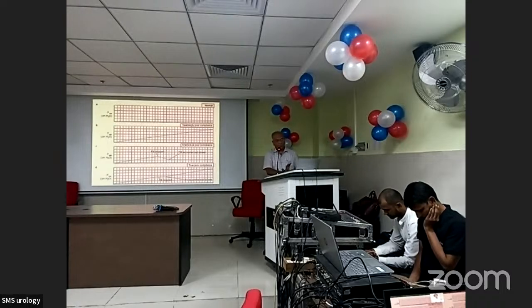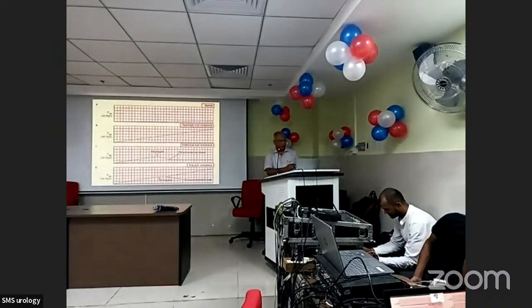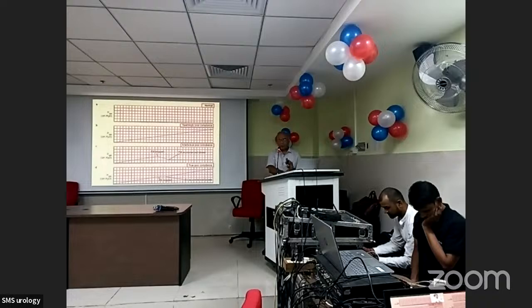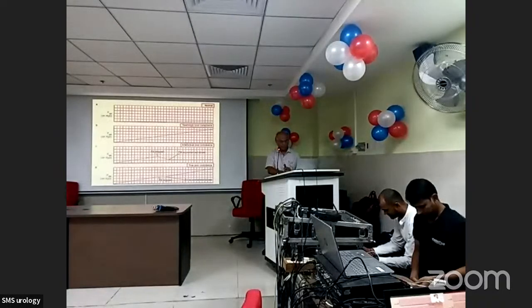Now, this is the difference I was talking about. First is the normal vesical pressure. In the second, the vesical pressure is constantly rising, so probably poor compliance may be there. Now, once we stop filling, this graph comes down to almost near the baseline. So that is artifactually poor compliance. That means the compliance is actually not that bad, but it was probably associated with a higher fill rate. If it doesn't come down and the pressures constantly keep on rising, that means it is true poor compliance. So this is what we need to actively find out during a study.